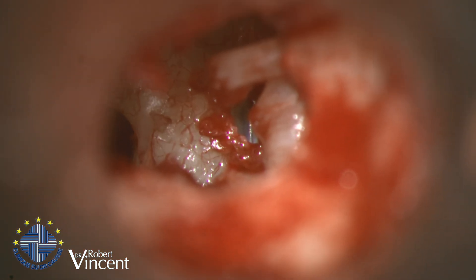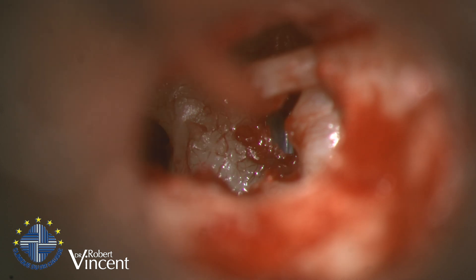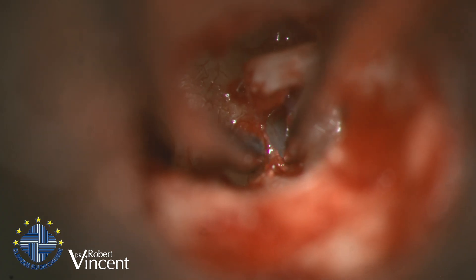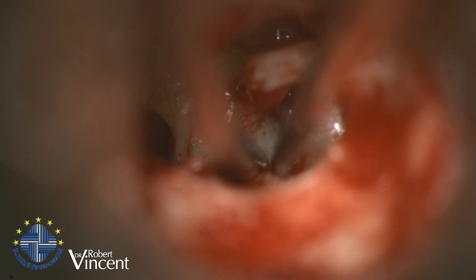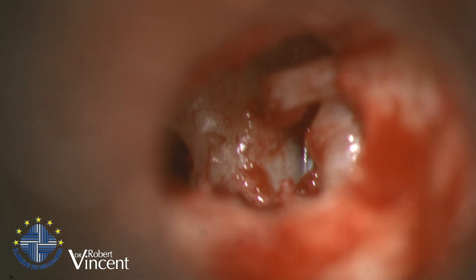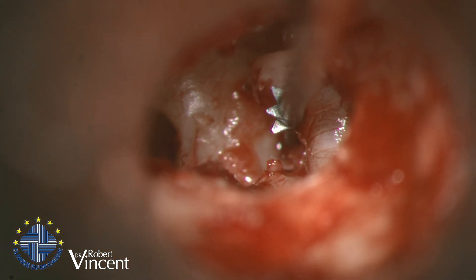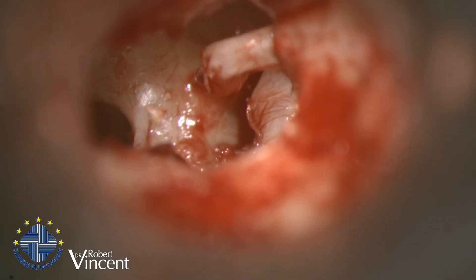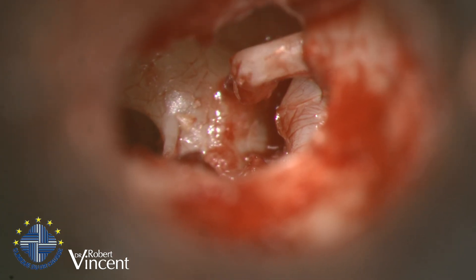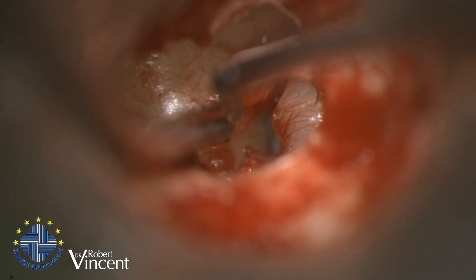Now the problem is that I don't have a clear access to the footplate. I need to check the malleus-incus mobility again because I had a feeling there was a slight decrease in malleus mobility that was not completely clear. I will measure now and recheck. It measures 4.5 millimeters. Now checking the malleus again — okay, it's fine, there's no problem.